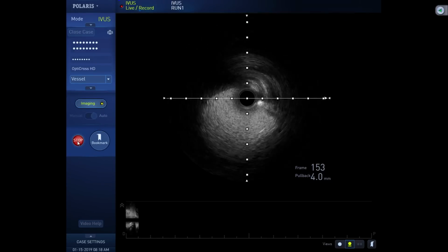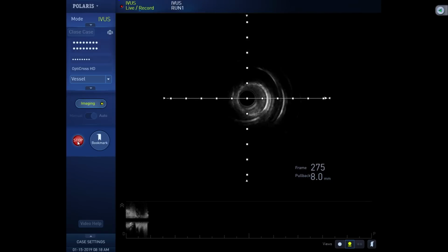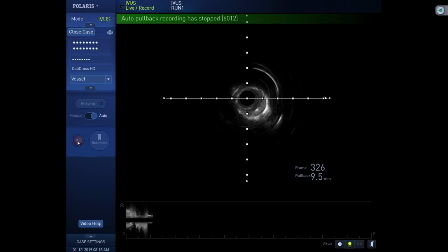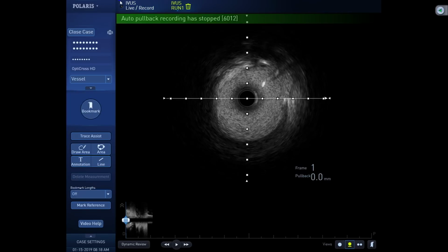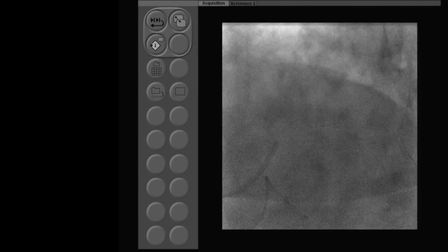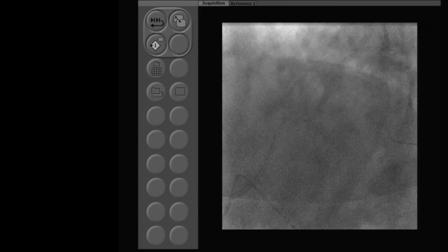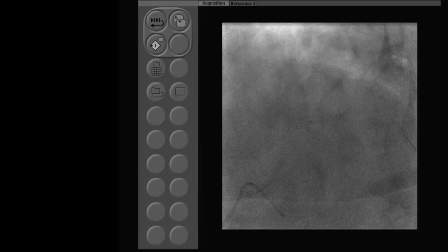I think it's just the way the vessel is taking off. You can see that, very critical left main. So very critical left main. Yeah. I think it's very eccentric and maybe not a good idea to push it. Yeah. That's all. You saw that, right?